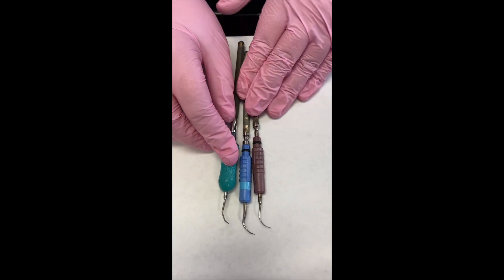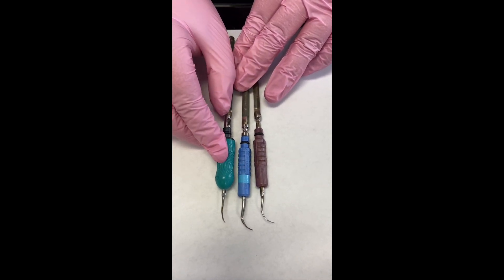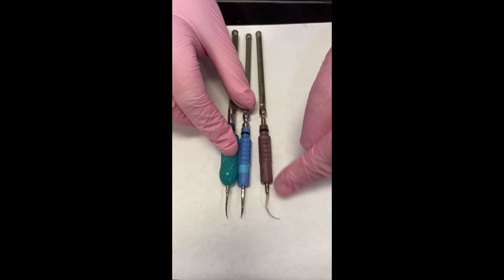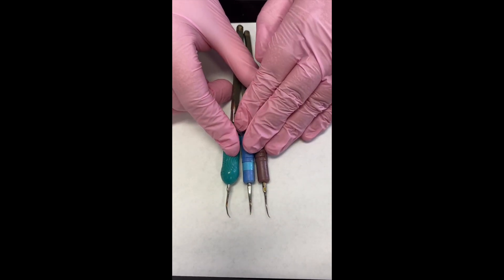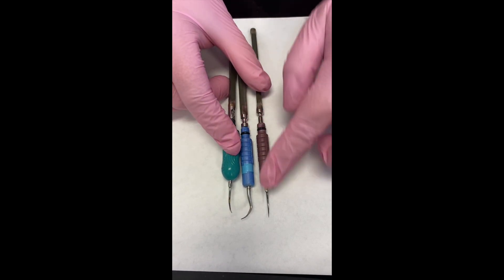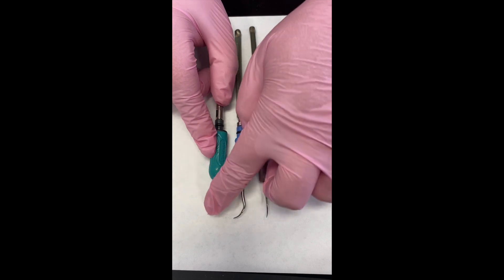There are lots of different ultrasonic tips on the market, and one of the key differences between them is the cross section. If you cut off the tips, it shows the cross section of the ultrasonic tip. This one and this green one — the cross section would be round.